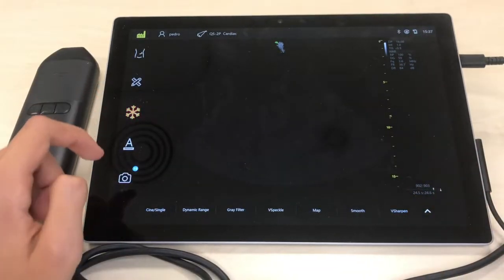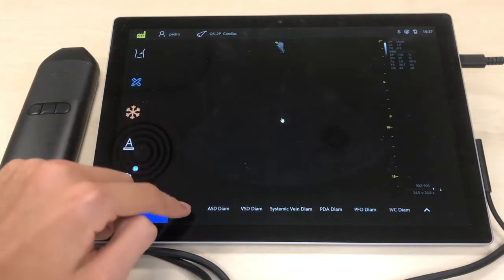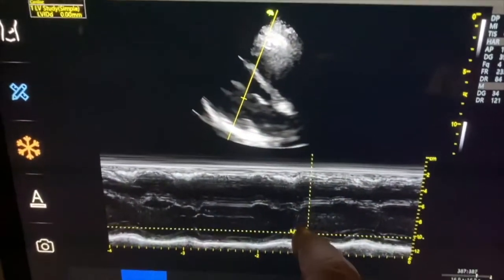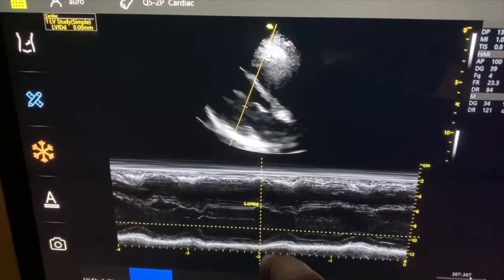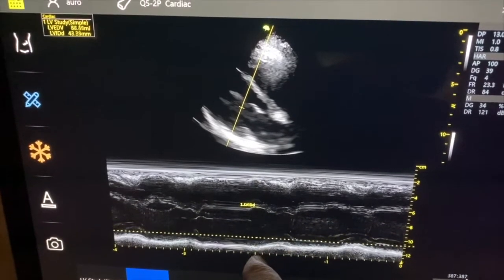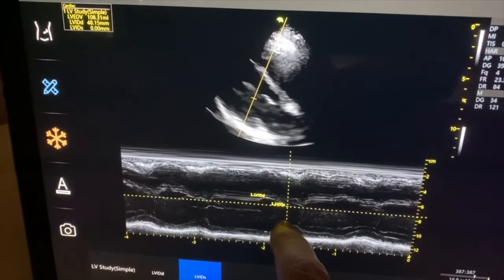The center bar freezes the image and displays some interesting tools such as those to measure distance, areas, and even calculate ejection fraction and more. Here you're seeing an M-mode image with the measurement of ejection fraction using the septal and posterior walls of the left ventricle in both systolic and diastolic phases.